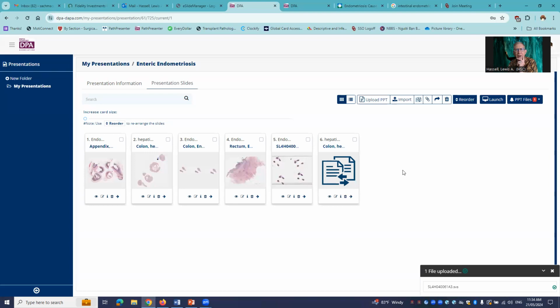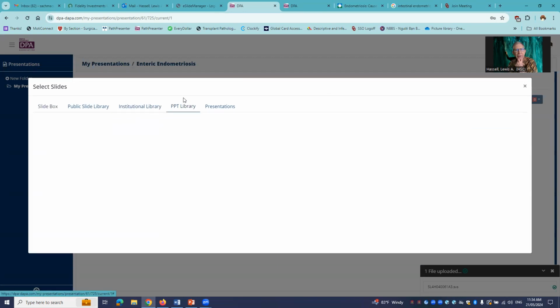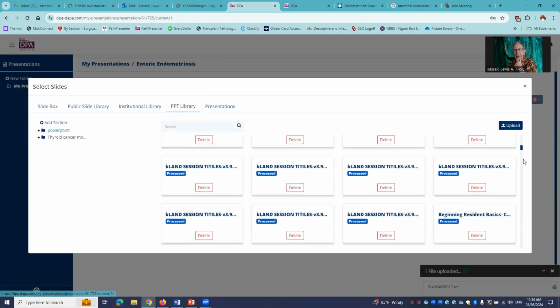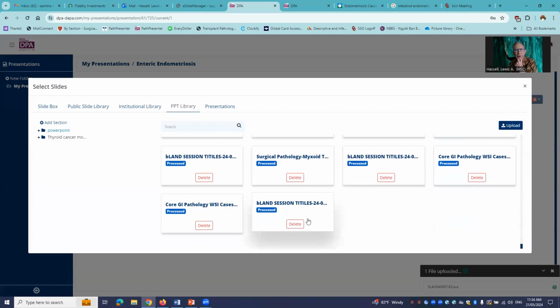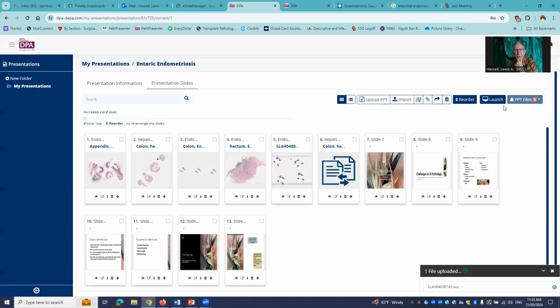Okay. So now we're going to import our PowerPoint. So I can upload and save into Path Presenter here my PowerPoints. And in fact, you'll see here that the other options here are a PowerPoint library. So if I come to my PowerPoint library and scroll down through, I know that the last one I uploaded is the one I want to use. And so this is the one that I'm going to bring in here. And there they are right there. I can choose any or all of them, and I'm going to select them all.